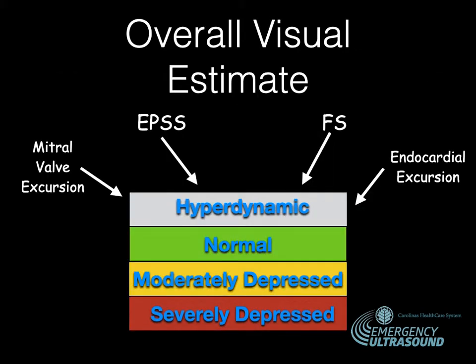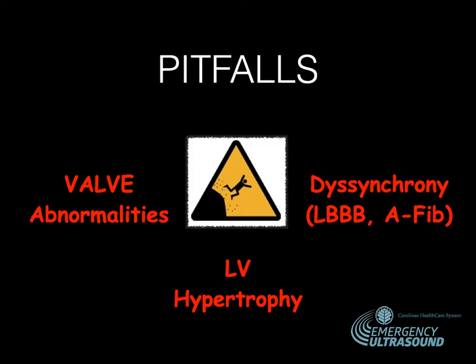Putting all of that together — mitral valve annular planar excursion, EPSS, fractional shortening, and endocardial excursion — we classify cardiac function as hyperdynamic, when the walls of the left ventricle are nearly coming together, normal, moderately depressed, or severely depressed. Some pitfalls include valve abnormalities and dyssynchrony. It's very hard to estimate an ejection fraction if the patient is in AFib, or if you have left ventricular hypertrophy.